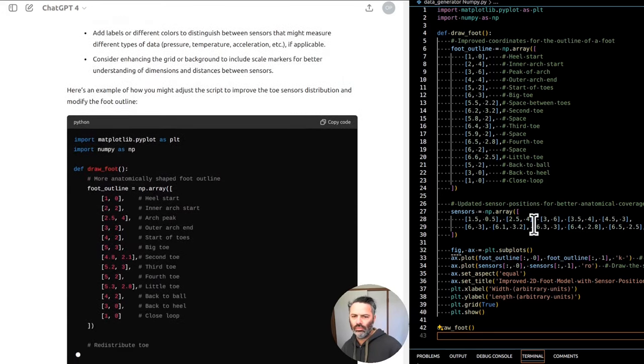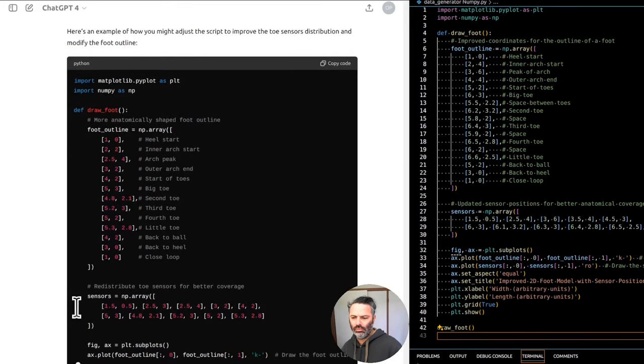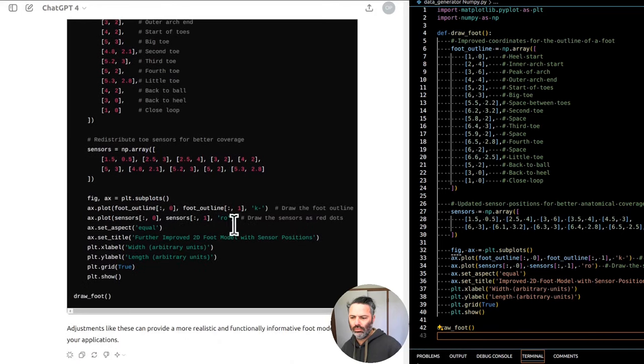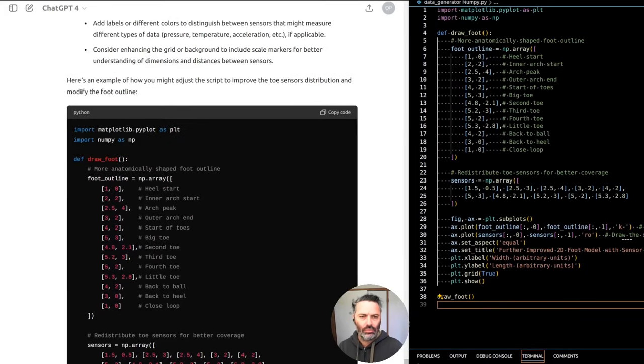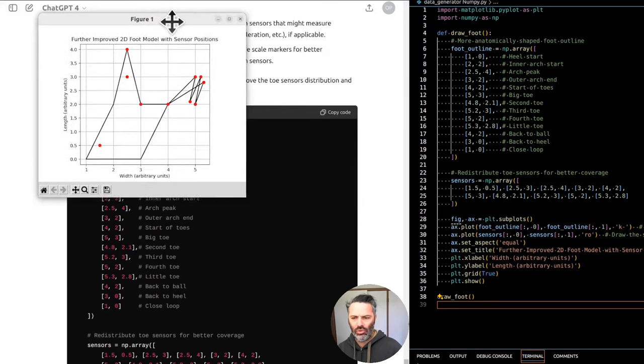3. Improve visual clarity. Enhancements can be made in the graphical representation to make it clearer and more informative, such as adding labels or different colors for different types of sensors, if applicable. Looking at the updated image of the 2D foot model with sensor positions, it seems that while the overall placement and layout are more structured than the first version, there are still areas for improvement, particularly in how the toe sensors are distributed and the overall shape of the foot outline to more closely resemble a real foot.